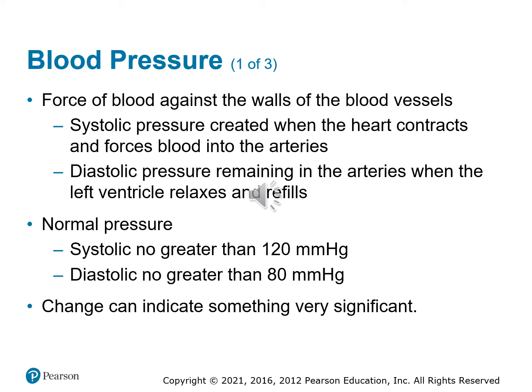Moving on to blood pressures, and blood pressures are probably going to be the most challenging skill to learn from everything in this chapter. It's just a technique that takes a lot of practice to be good at. People rely entirely too much on machines to give them the blood pressure.